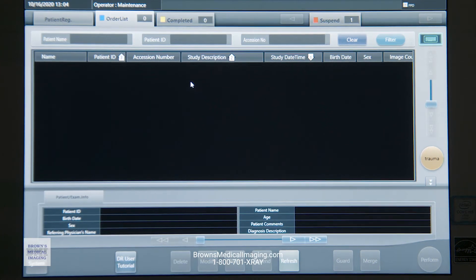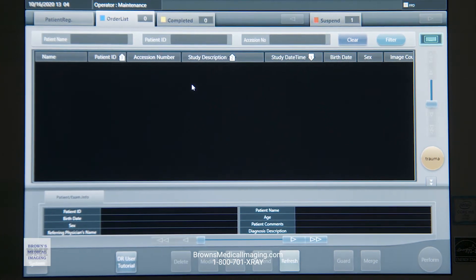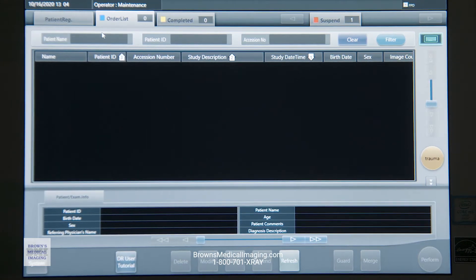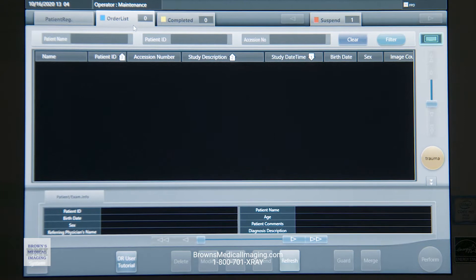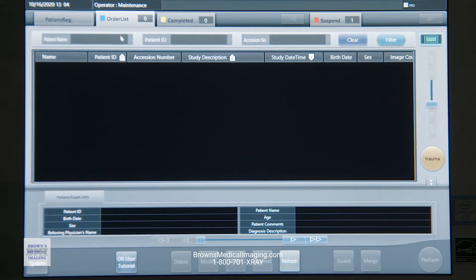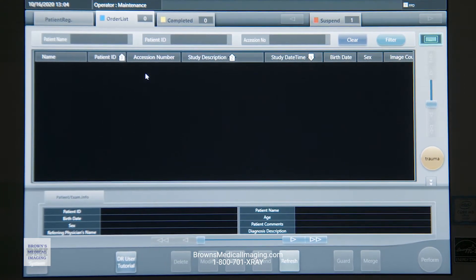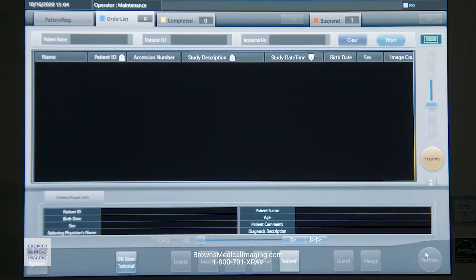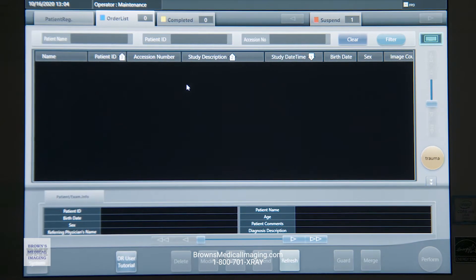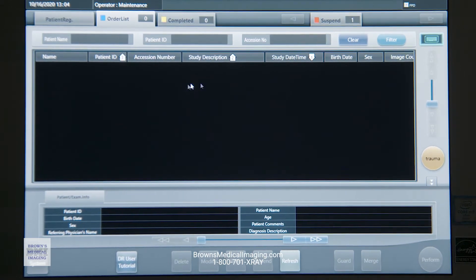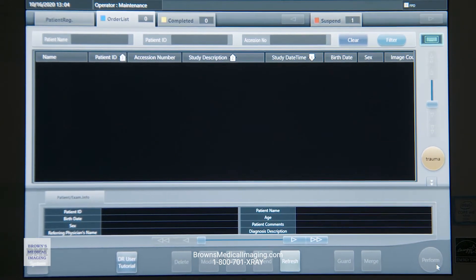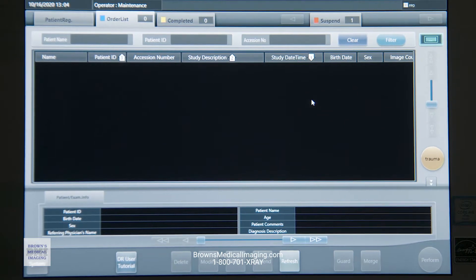We're talking about the Konica Minolta CS7 software. When you log in, the first thing that's going to pop up is your order list. This is where we're working 99% of the time. We've got our list of patients, we select from that list, come down to the bottom and hit perform. We're going to procedure map all those studies so that you can have your views and exam tags built in automatically.